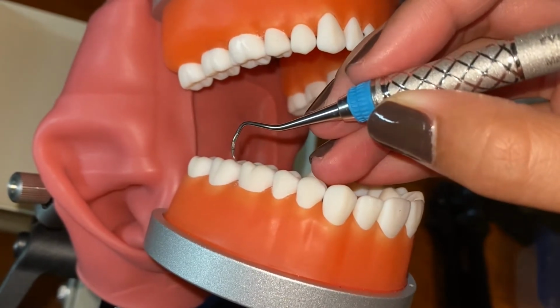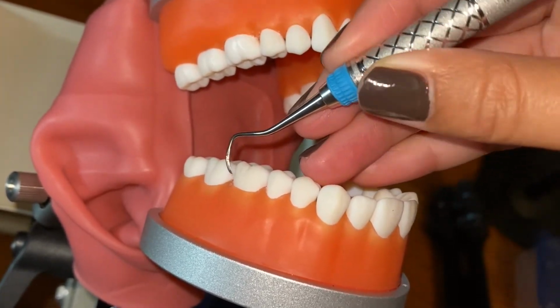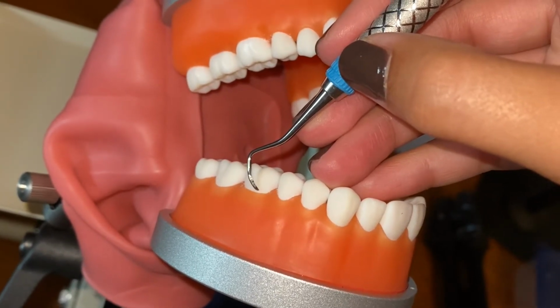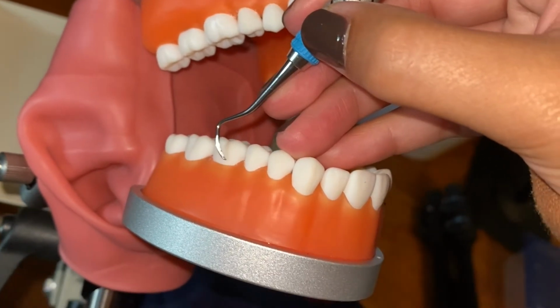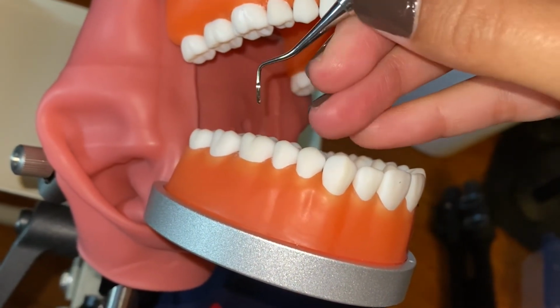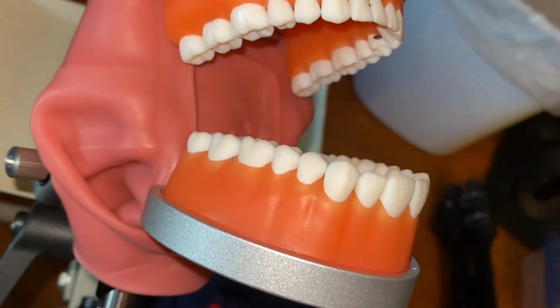Using the correct working end, we can see that if my instrument is pointed towards the mesial surface of the tooth that I want to work on, the face of the blade is again facing towards the tooth. Incorrect working end, face of the blade away from the tooth. Okay.